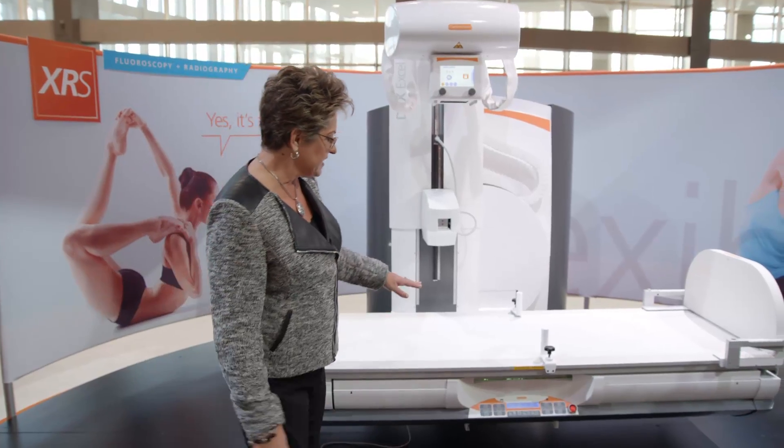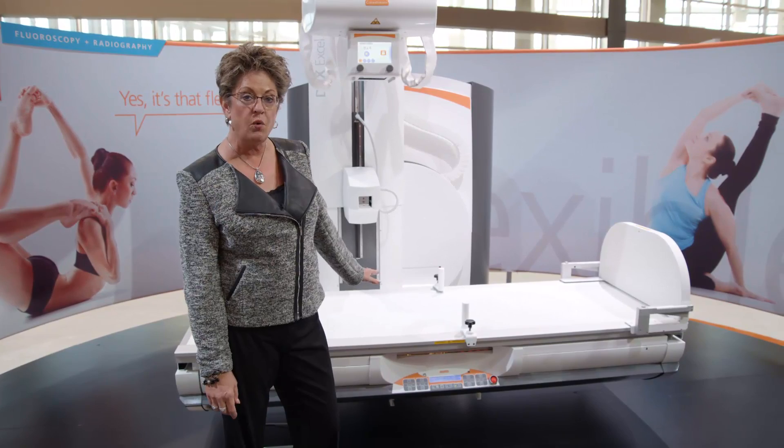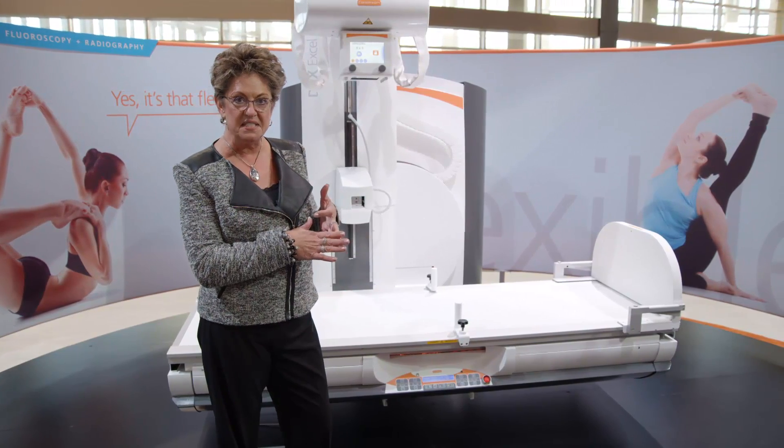We do all of that with a fixed 43 by 43 dynamic detector, and that's acquiring our still images, our fluoroscopy, and our pulsed image fluoroscopy.